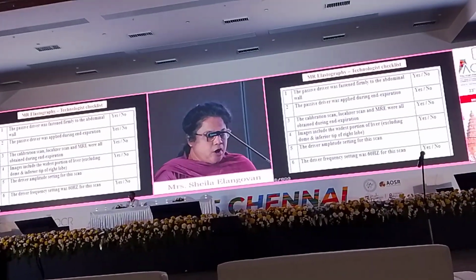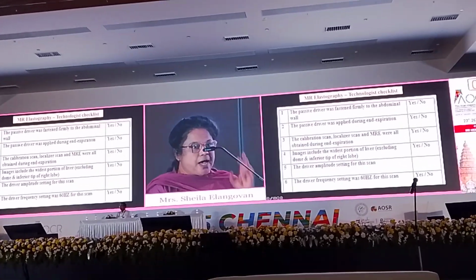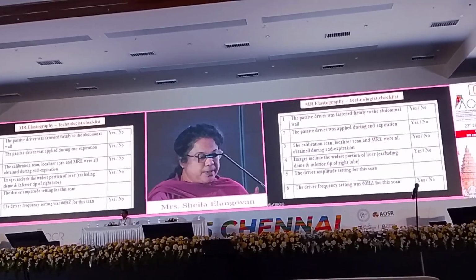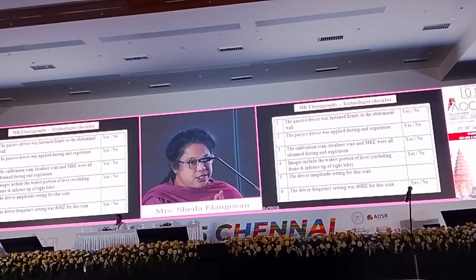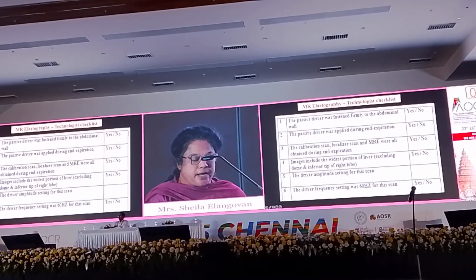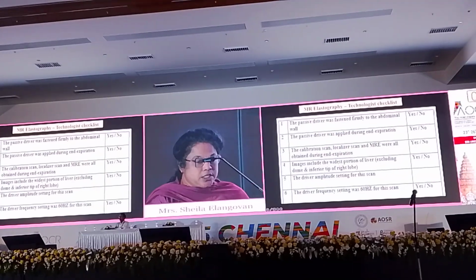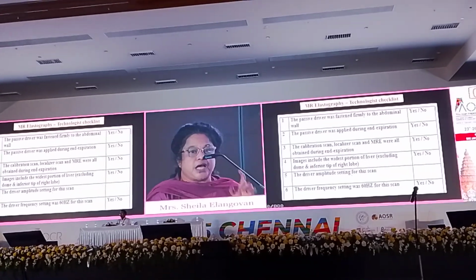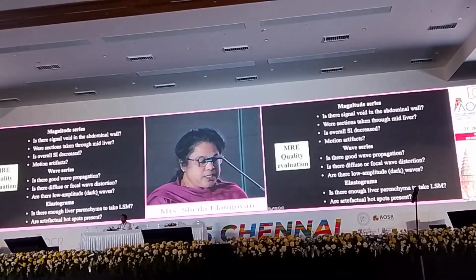As technologists, the first thing that you should see is whether the passive driver is fastened correctly onto the patient's abdomen. Checklist. Whether the passive driver is applied and the image acquired during end expiration, whether the calibration scan is done, quality control is important, whether you have included major portions of the liver, and whether the driver amplitude and the driver frequency of 60 Hertz are correct. That is very important.